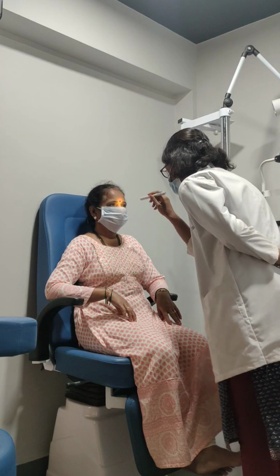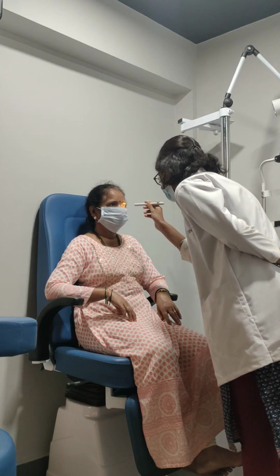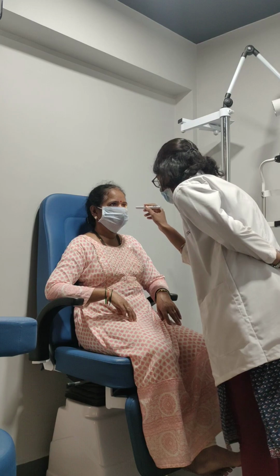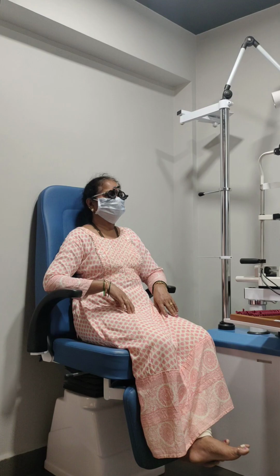After the interview is done, you have to do the basic external ocular assessment, like the ocular motility or the alignment of the visual axis, and also the pupil reaction. After the ocular assessment, we have to do the contrast and glare assessment, and also the visual assessment, distance vision and near vision, monocularly and binocularly, with pinhole and without pinhole. We have to note it down.